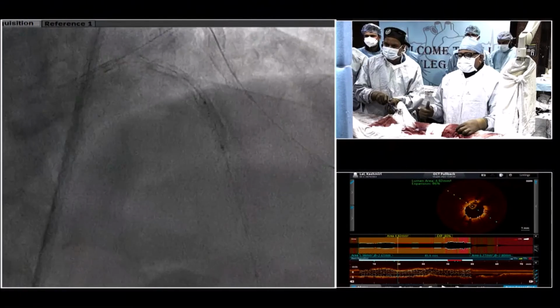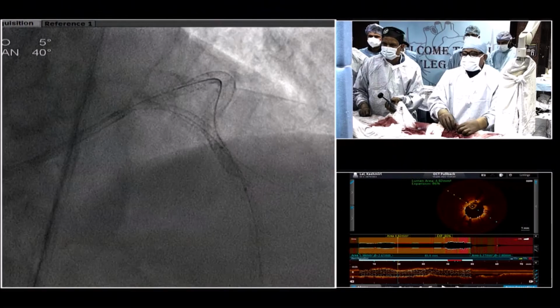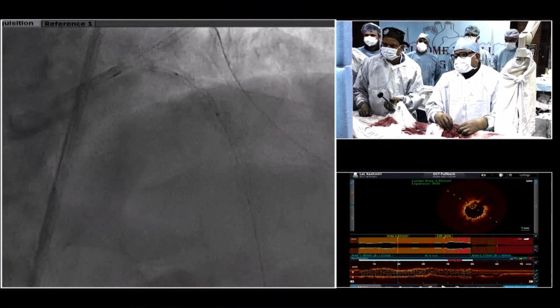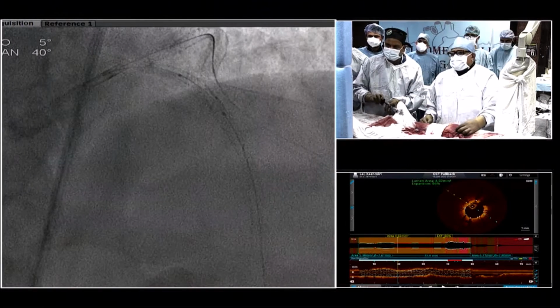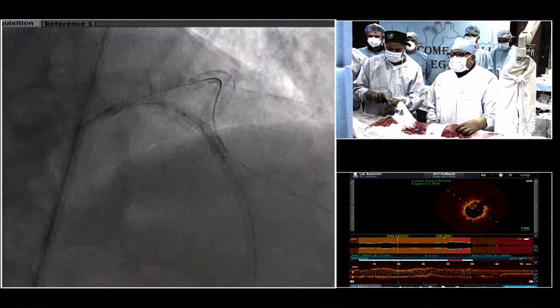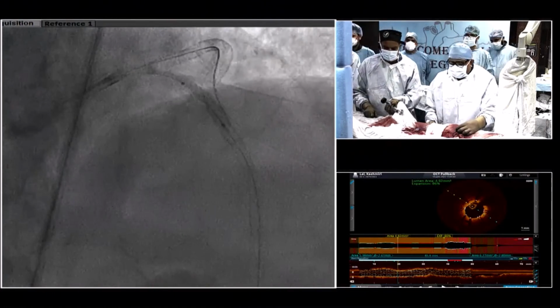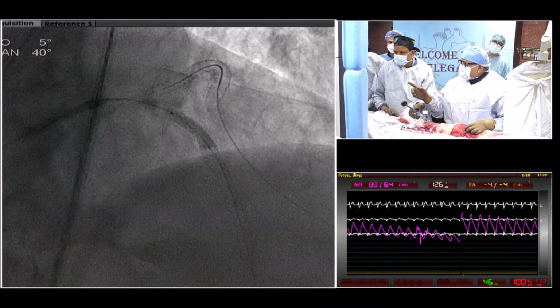Only when you have a lot of calcium and a nodular calcium there. Okay, I think Dr. Rajesh, since we have to go to Germany, let's move around in the Germany in a good weather. Yes, please. So you please carry on with your work fully. Over to Germany. Fine, fine. So, fine, okay. The blood pressure is going down.